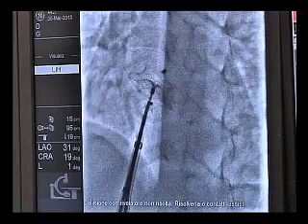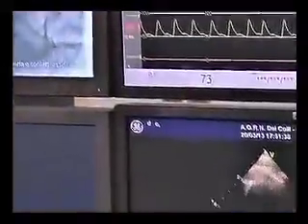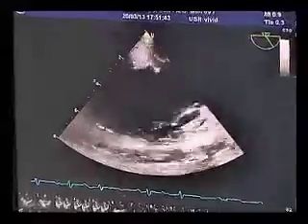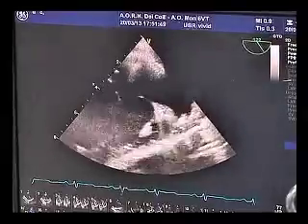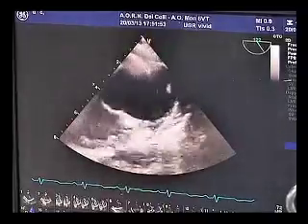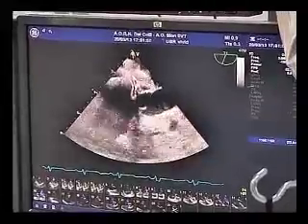Let's check by echo. With the color. 45 degrees.